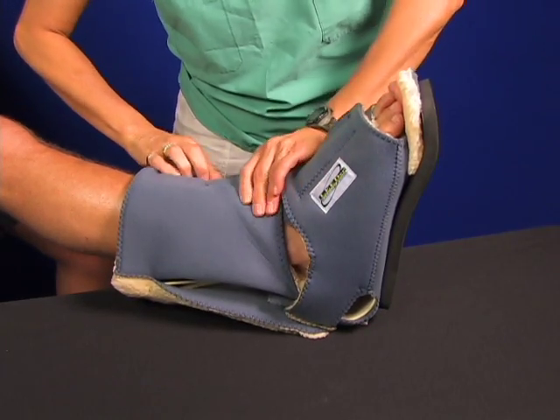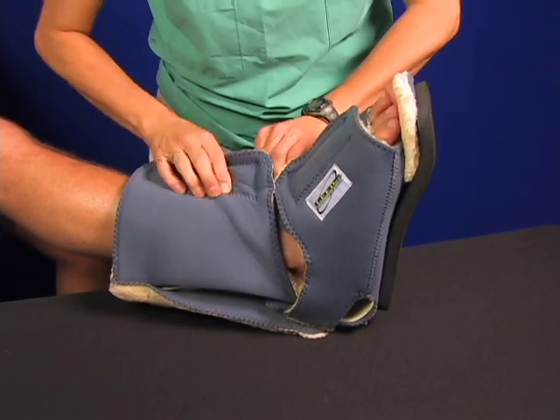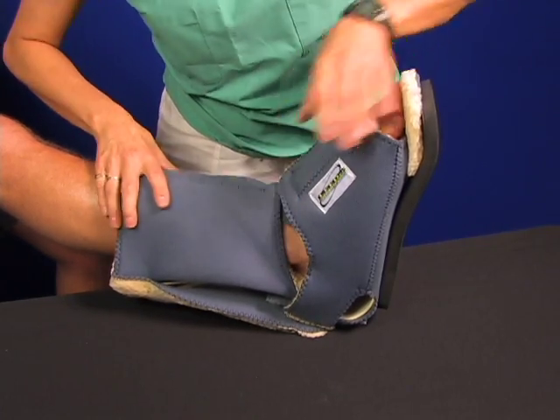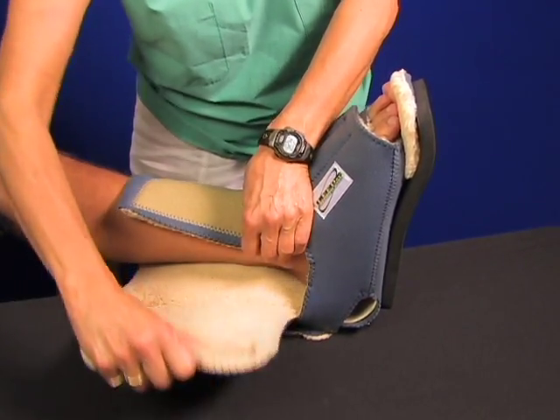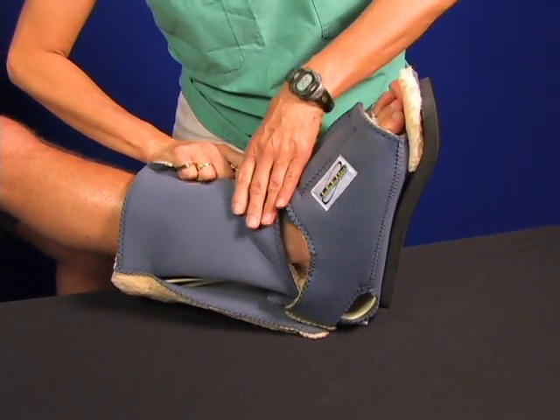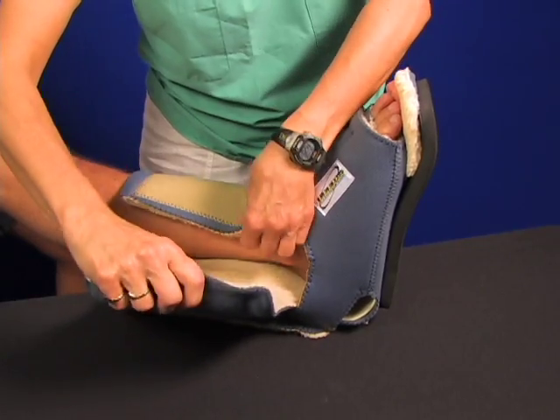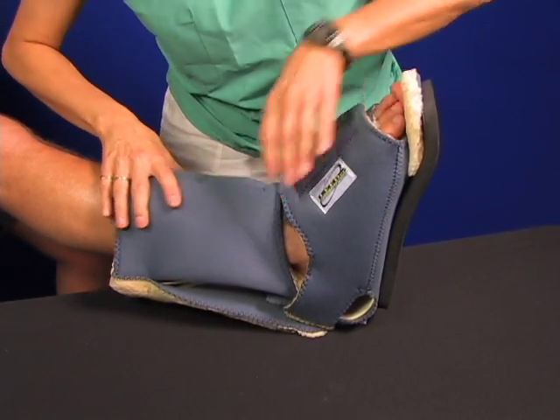Here's an interesting point — you can see where the top cover isn't closed perfectly. The nurse is opening it back up and going to properly pull the top closure down to pull the instep into the boot. The advantage of that tall closure on top is that it eliminates the need for an instep strap, because the lower area of the closure strap performs the same function. It counteracts foot drop and pulls the heel back.